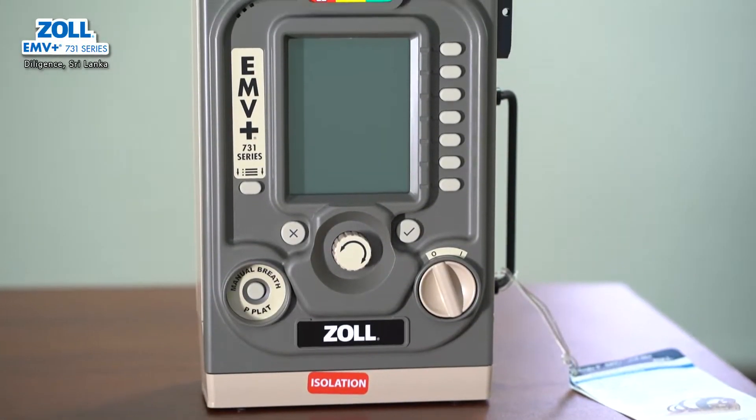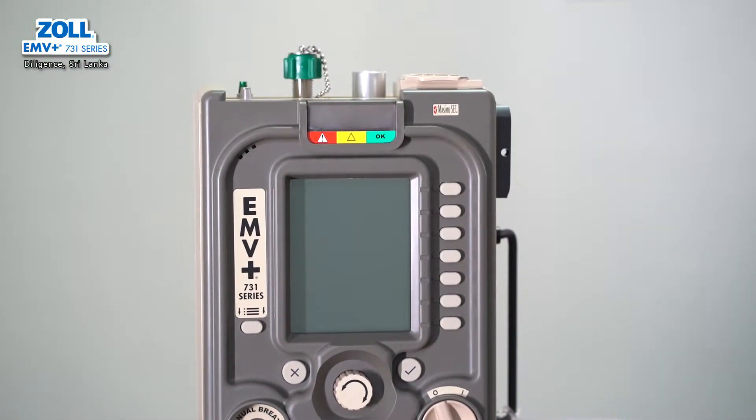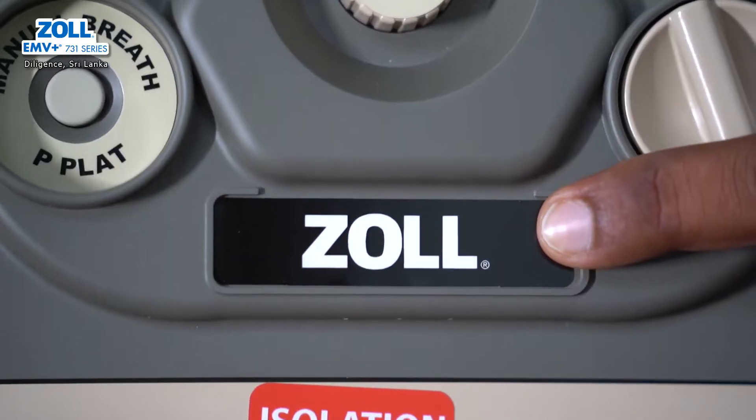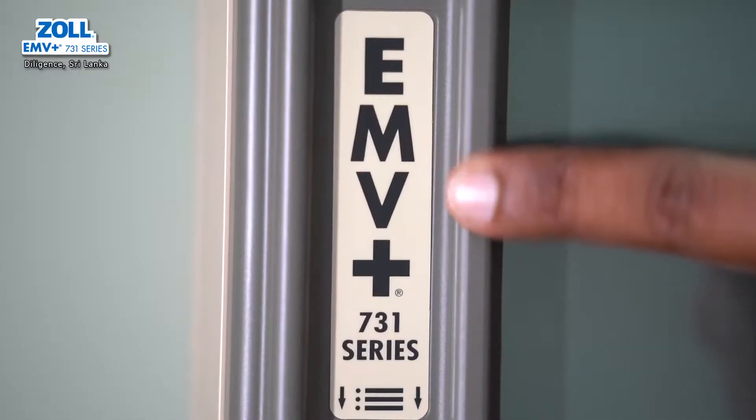Hi everyone, my name is Diligence Hightening. I have a portable ventilator. The brand name is ZOLL, it is a USA product. My model is EMV Plus.